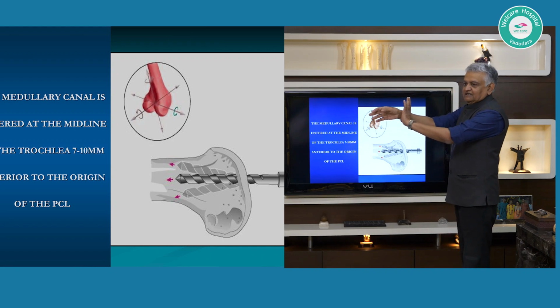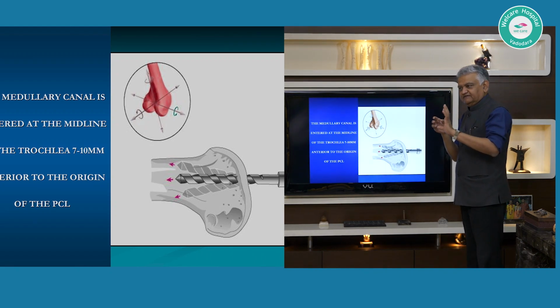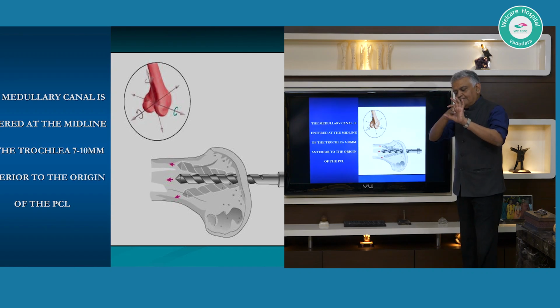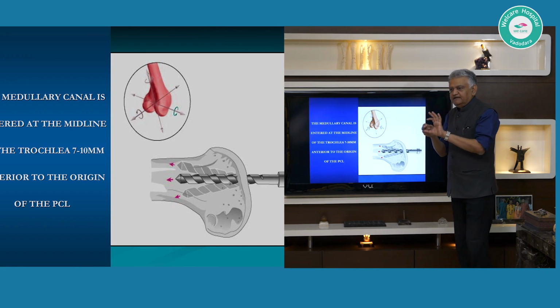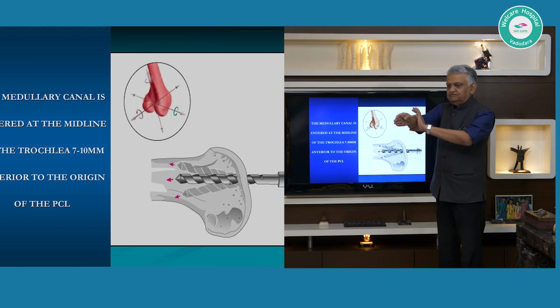If it is a very tight fit like this, if your lateral cortex, whether it be the guide wire or in this case the femoral drill bit, if you have drilled the femoral drill bit in and the hole is exactly the same dimension as the drill bit itself, now it is this which will force my further progress of my drill or a rod or whatever guide wire.